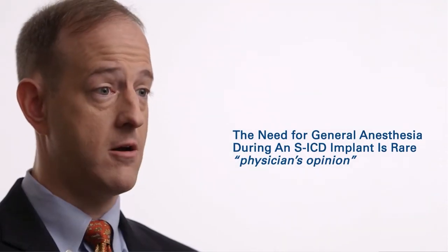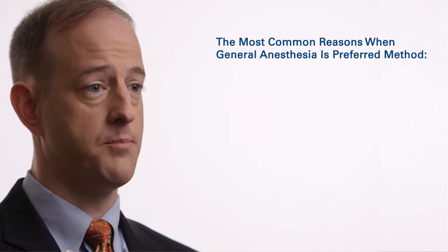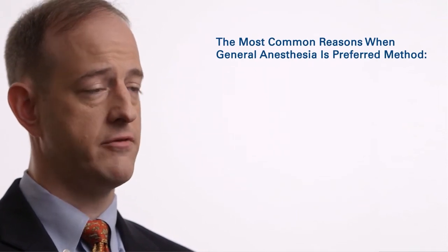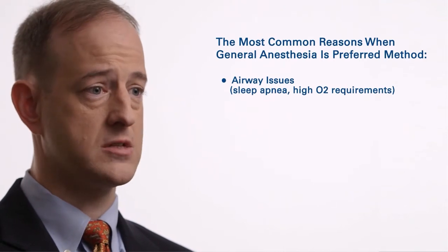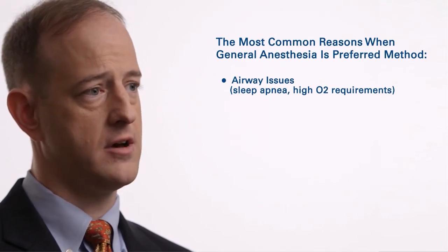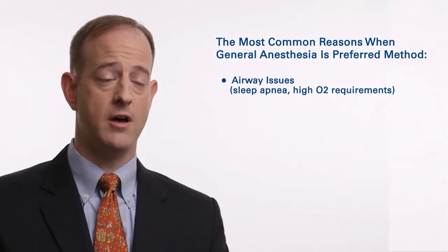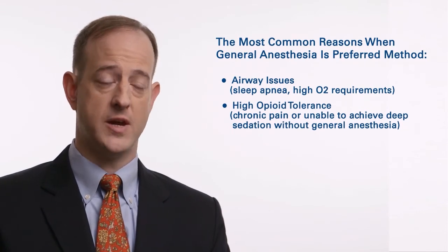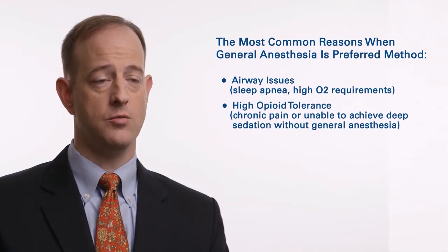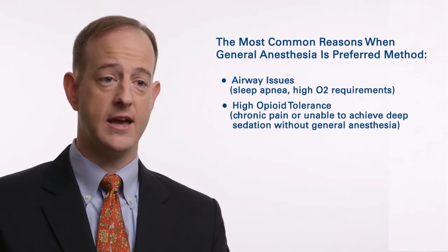In that small minority of patients, the most common reasons that it is the preferred method usually involve airway issues, such as those patients with severe sleep apnea or who have high oxygen requirements, or those patients who have high opioid tolerance, like those patients with chronic pain, in whom achieving a deep level of sedation without general anesthesia is difficult.